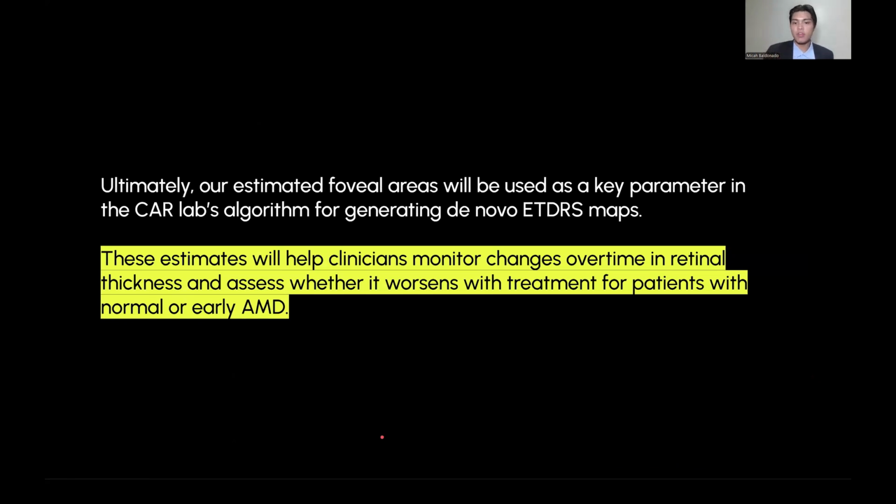Ultimately, our estimated foveal areas will be used as a key parameter in the CAR Lab's algorithm for generating de novo ETDRS maps. These estimates will help clinicians monitor changes over time in retinal thickness and assess whether it worsens with treatment for patients with normal or early AMD.